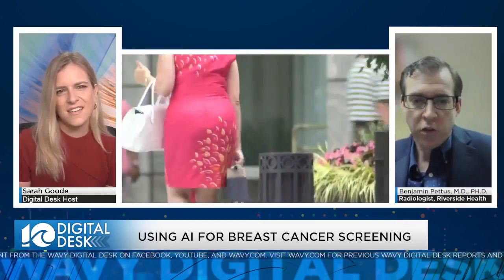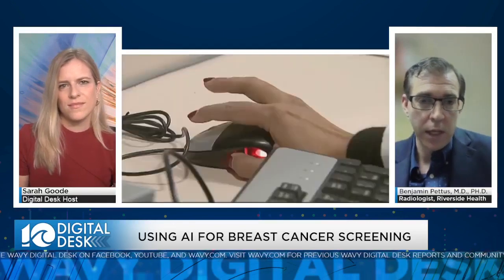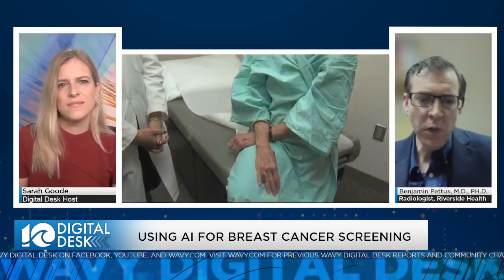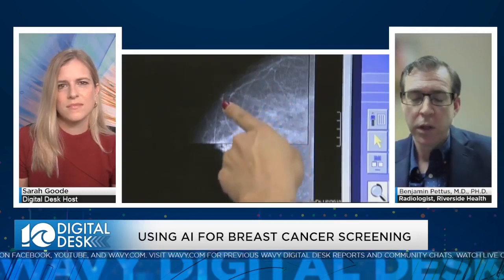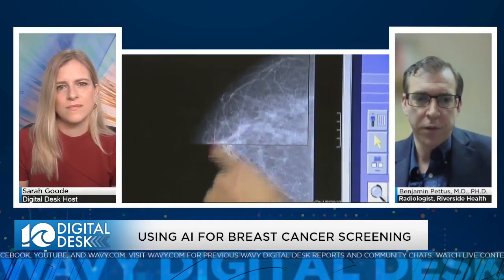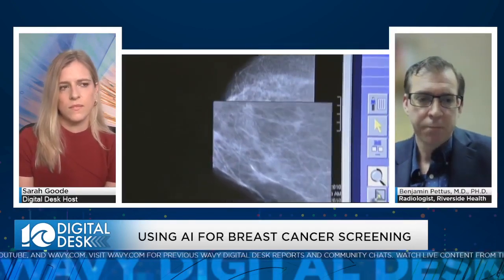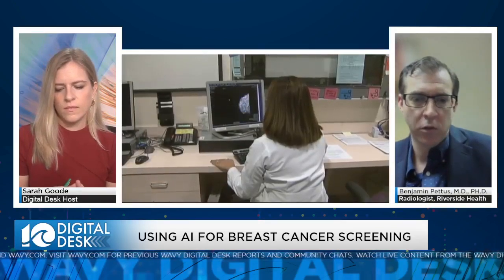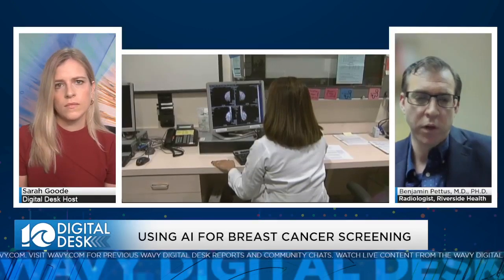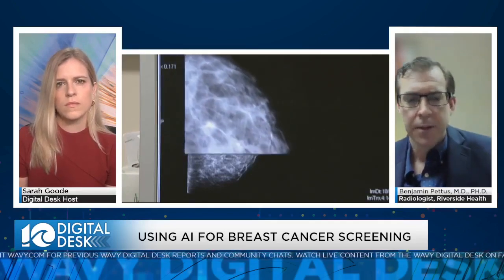Well, it's a good question. I don't know that we necessarily are doing this because we feel like we need it. But, again, everybody's human, and like I said, we want to use every tool available in a reasonable way. You want to be careful with what I call the law of unintended consequences. You don't want to in any way create a bias. So we've added this AI on the back end. So we do our work, what we normally would have done, and then we see kind of what this computer algorithm is going to highlight.